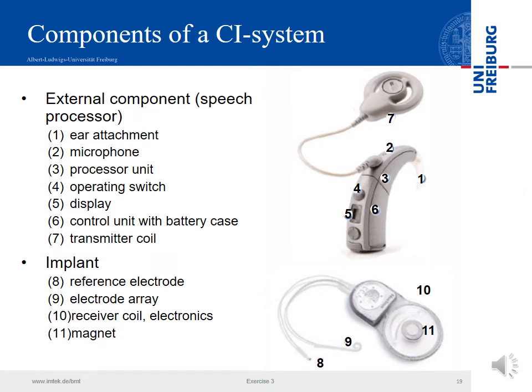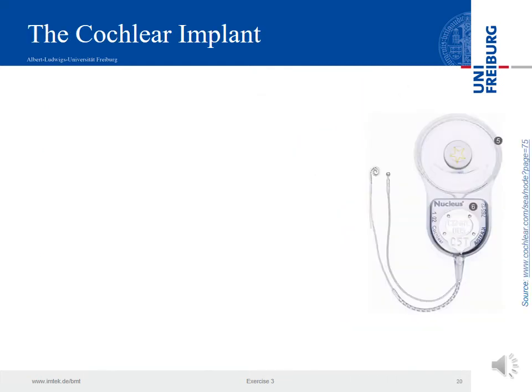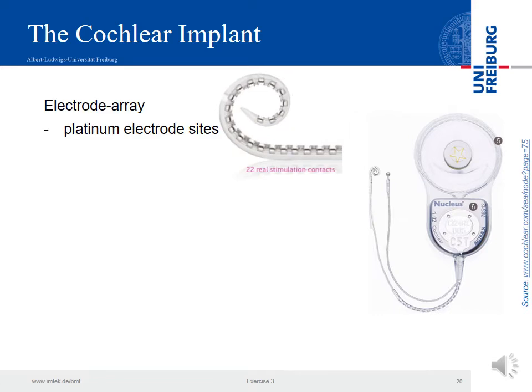Magnified, the stimulation array, we see 22 platinum-based stimulation contacts. The package is made out of ceramics and titanium. This is now from MED-EL.